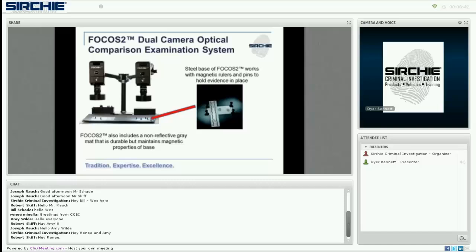The base and included mat provide optimal background surfaces while working with many types of evidence that can be easily anchored with the included magnets. The camera assemblies are fully mounted and ready to have the cords plugged into the computer, turned on, and ready to go. You can be ready to work in mere minutes.